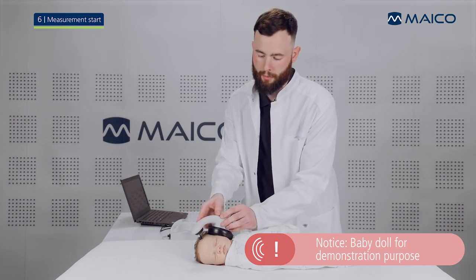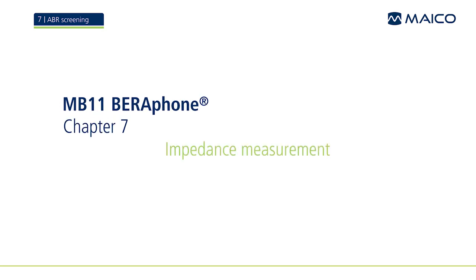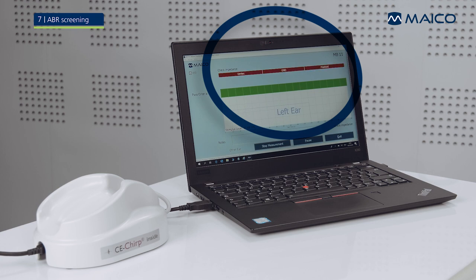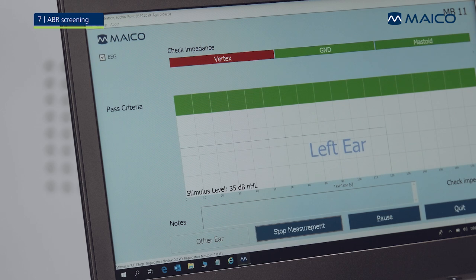Before the actual measurement, the software will check the impedances of the electrodes. The quality of the electrode impedances are displayed at the top of the screen. When all three electrode fields are colored green, the impedances are okay and the screening will start automatically. A yellow coloring indicates that the impedances are not optimal but the measurement will start anyway. If any fields are colored red, the impedances of the corresponding electrode are not good enough and need to be reworked — the measurement will not start in this case.